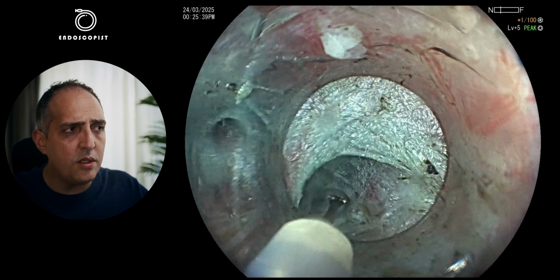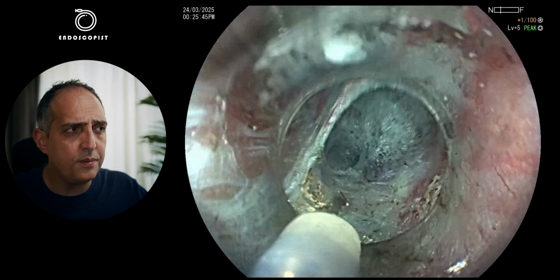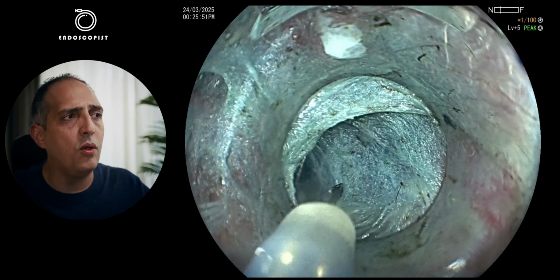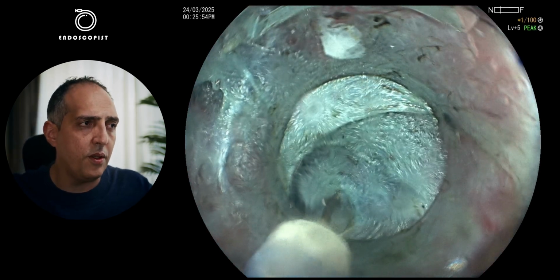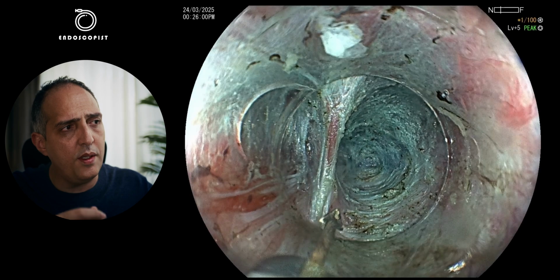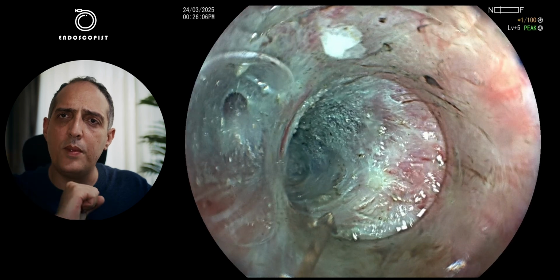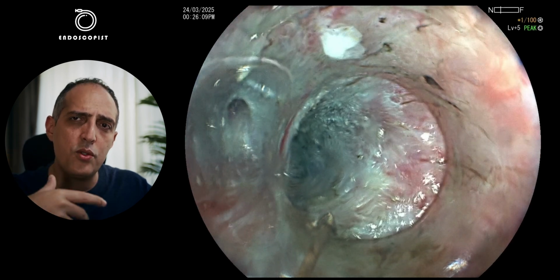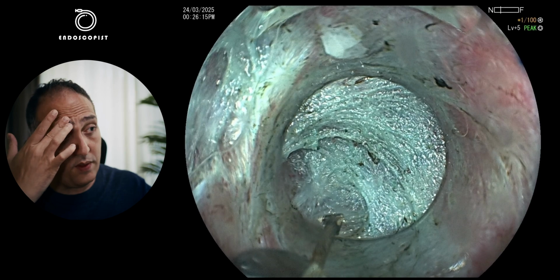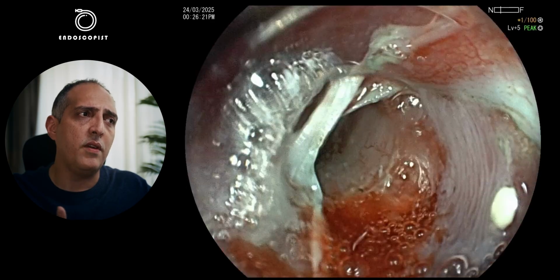And I'm trying to be very cautious not to injure these penetrating vessels, because when they bleed, it's usually strong bleeding. I push my scope again with mechanical force to open the third space here, or the submucosa. Now I have seen with my scope the second penetrating vessel, which is also a good landmark for your limit for the myotomy. So when you reach the second penetrating vessel, you are usually deep enough for your myotomy. As you can see here, to the right we have the circular muscles, and to the left of the penetrating vessels we have the sling muscle fibers, which, again, theoretically have some protective effect against reflux.